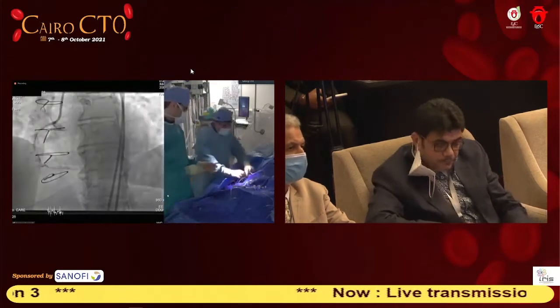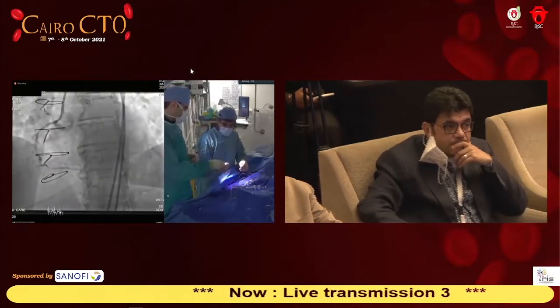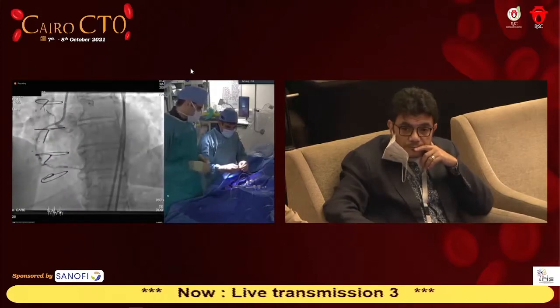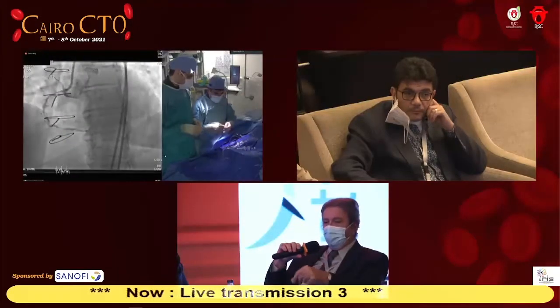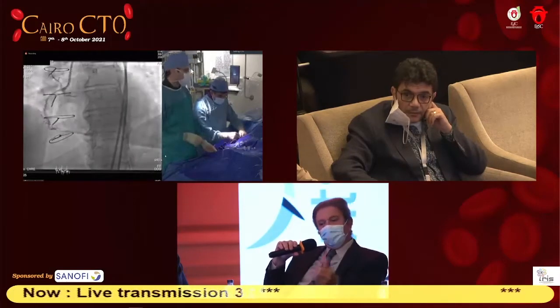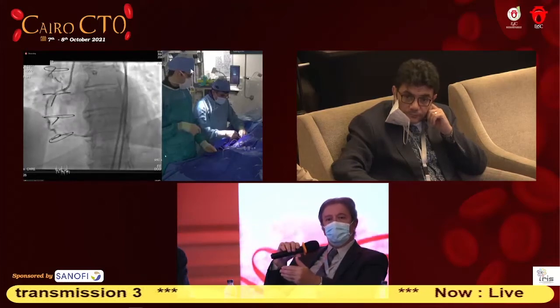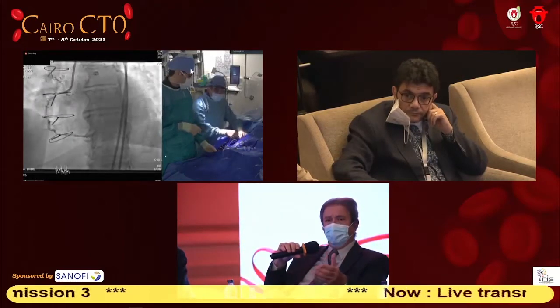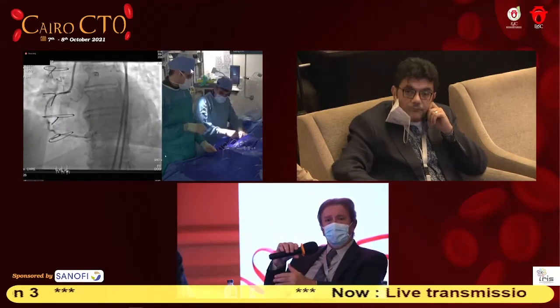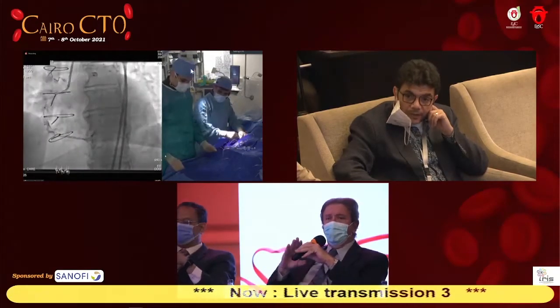Okay. So this is the con: if you leave the graft, you will have competitive flow, and with multiple stents in the right coronary you might disturb the flow and cause thrombosis. The pros, I think, are that you still have blood going to the distal vessel. If something goes wrong in the right coronary, you still have a backup with the graft. I would never close a healthy graft.